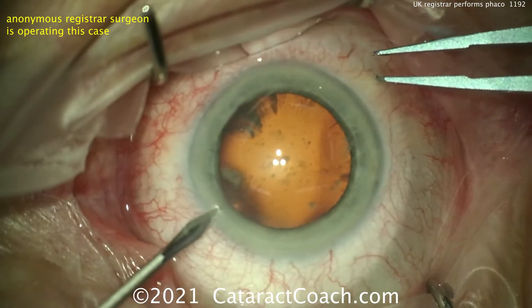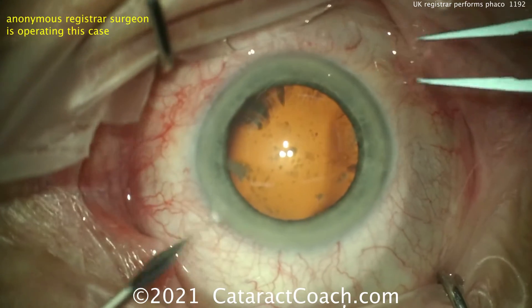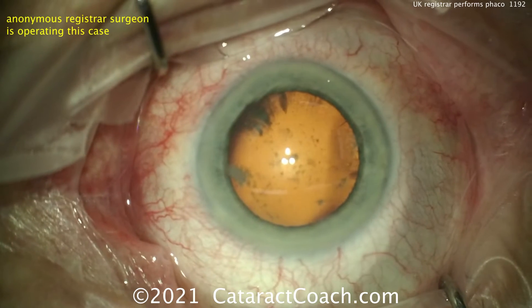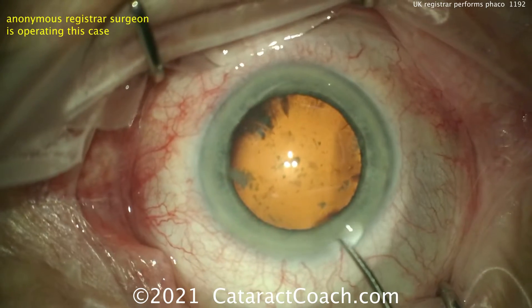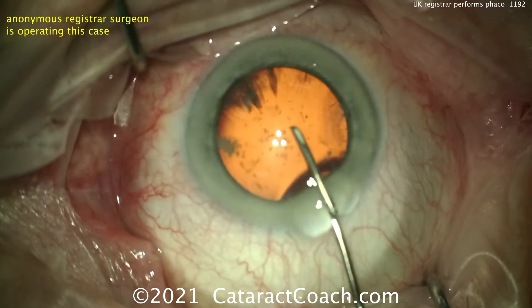And now here's the paracentesis. You can make these incisions in any order. When you see me do it, I do the paracentesis first and then put the lidocaine, then the viscoelastic — but it doesn't really make a difference.